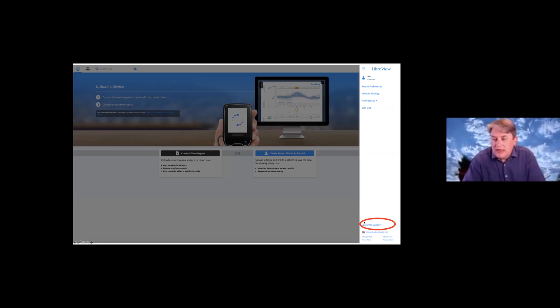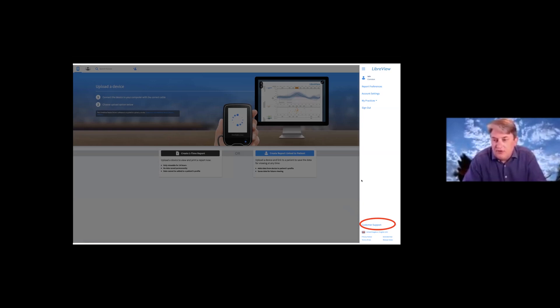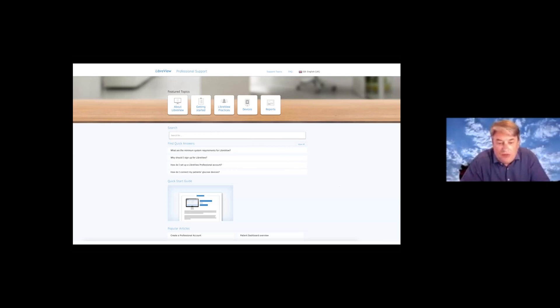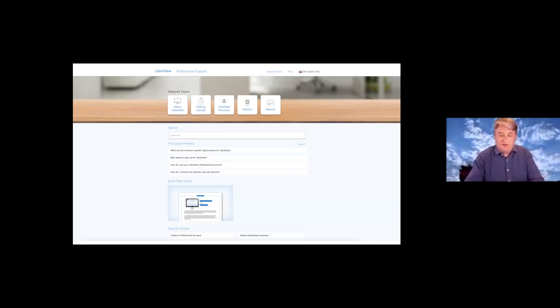Also worth looking at is the customer support button right at the bottom, because there's an awful lot of information in it — and it doesn't mean the only customer is a person with diabetes. The healthcare professional is a customer too, and there's a fairly wide range of professional support options that can both help you as an individual using the software and also help your IT team when they're looking at setting it up in a hospital environment.